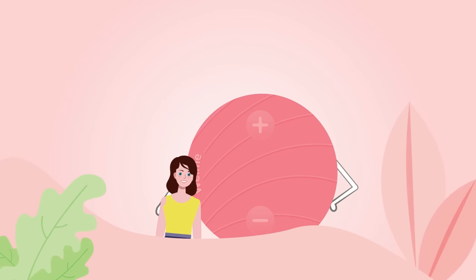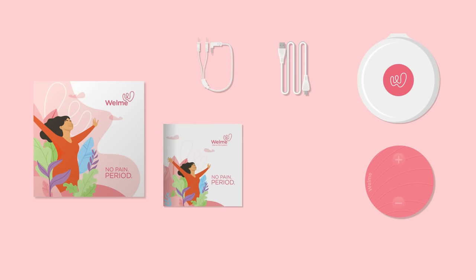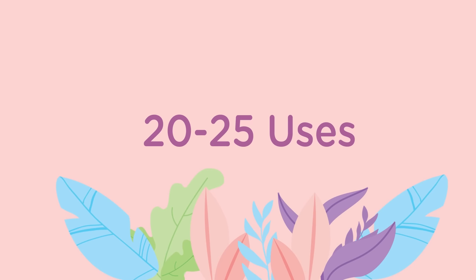Bye-bye discomfort! Hello freedom! Inside your Wellme box of freedom, you will find your Wellme device, Wellme casing, a USB charging cable, electrode patches cable, a user manual and a set of electrode patches which can last up to 20 to 25 uses.